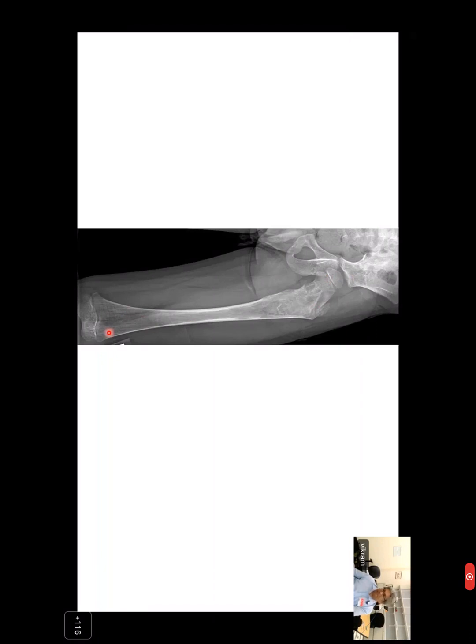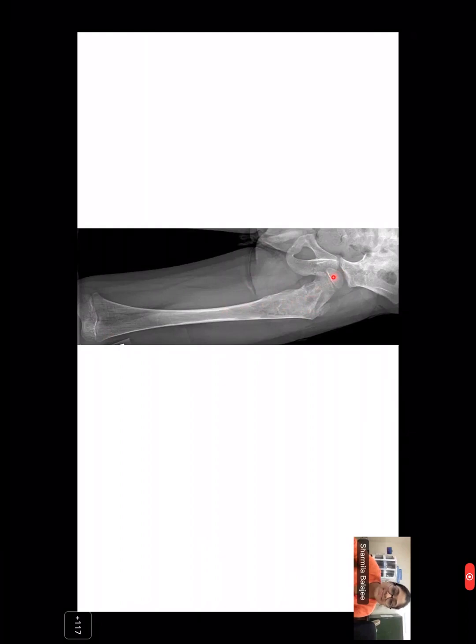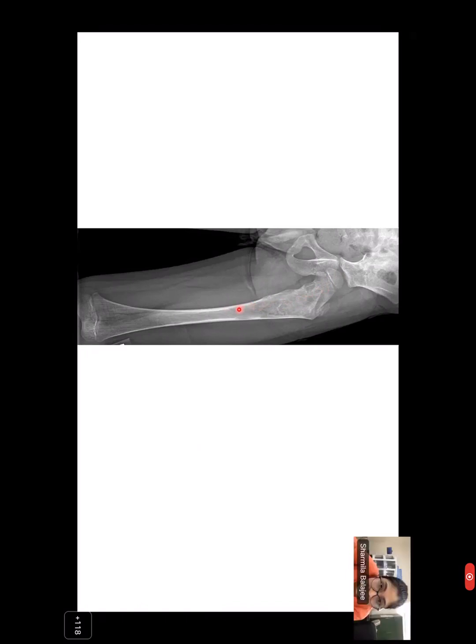Manish, do you want to help Sharmila with this? I think let Sharmila start, sir, I've just taught her. Okay, so now you've had a little bit of a primer. Why don't you start and try to interpret this? I know you haven't seen this before, but give it your best shot. It looks like there's a lesion in the epiphyseal-metaphyseal region. Very good. Epiphysis is above the physeal cartilage, above the physeal scar. It's metaphyseal-diaphyseal. Okay, so a metaphyseal-diaphyseal lesion.